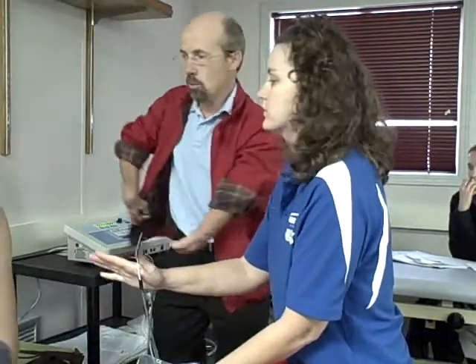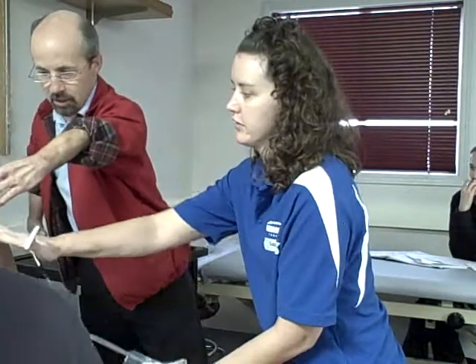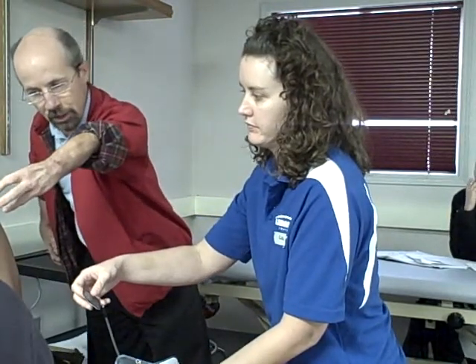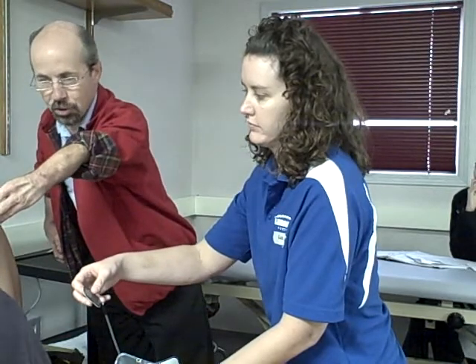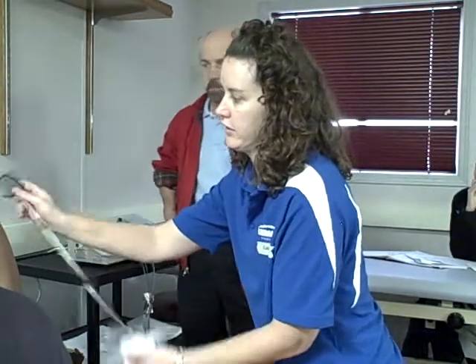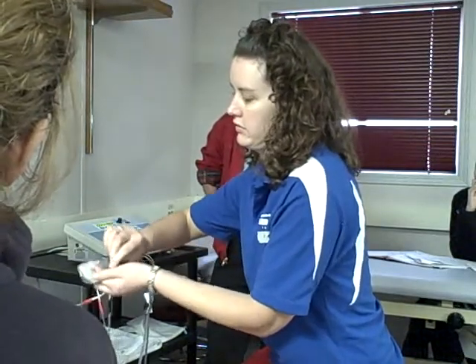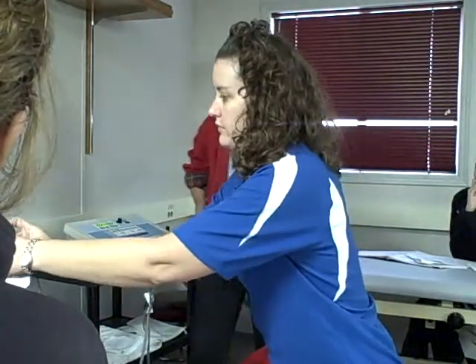So where's the area? Can we identify the area first? Well, okay, let's just say this is the target area, for whatever reason. We don't want to put an electrode directly over there, so we're surrounding the area. So if that's our target area, break your X pattern. So this is one.